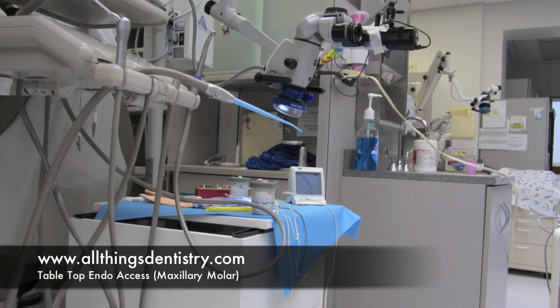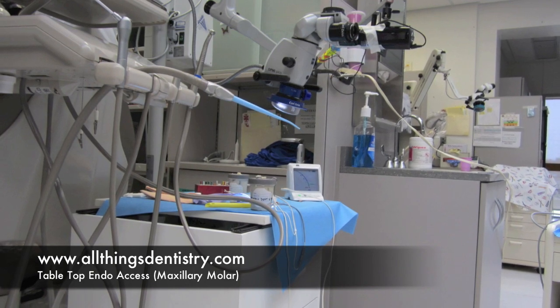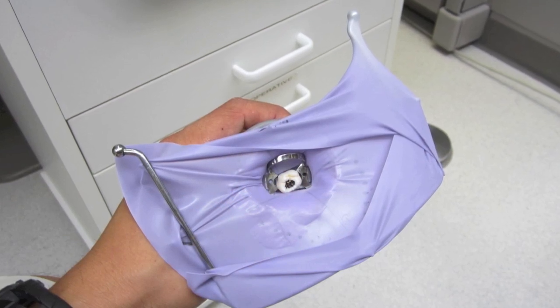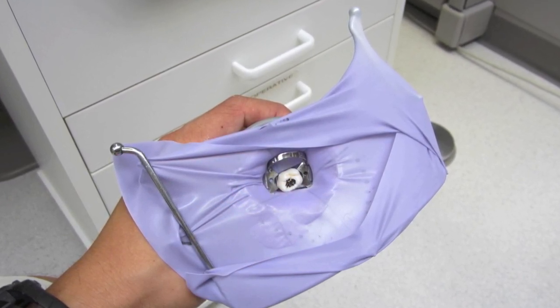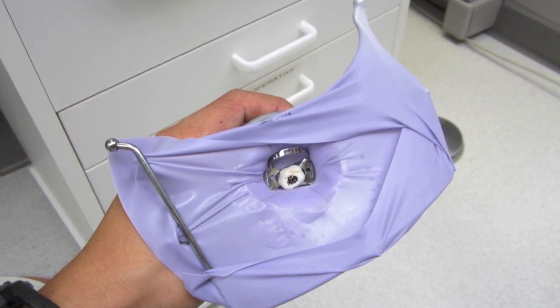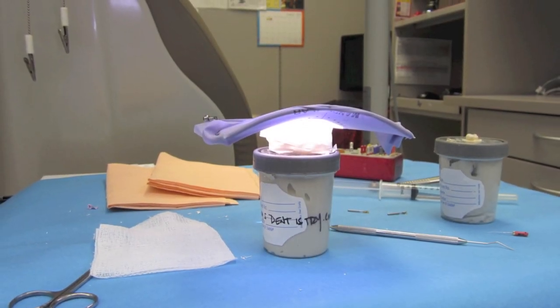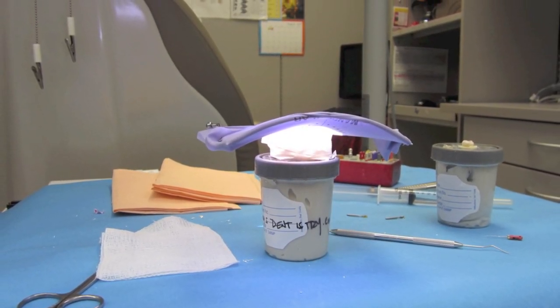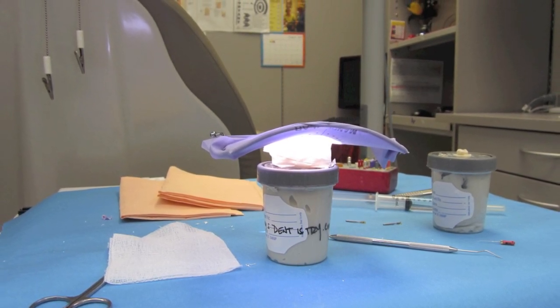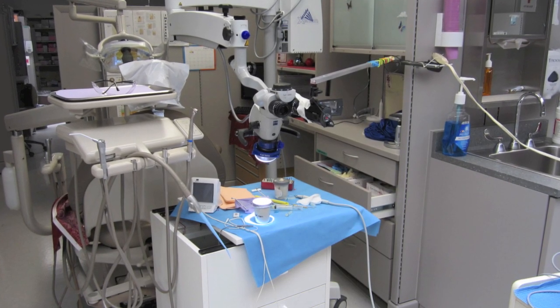Welcome back, Ashley here at AllThingsDentistry.com. Just taking a look at my tabletop setup for endodontic access. Here's the tooth in the middle, and what I did was put a rubber dam around it to try to mitigate any splash from the water and to make a cup around the tooth. I used 4x4 gauze and some masking tape — that's all I really had around, and it did work actually.